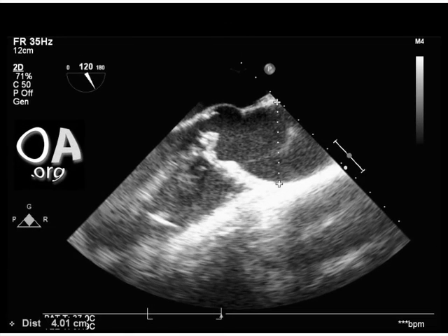This still image is a mid-esophageal aortic valve long axis view, found at a multiplane angle of 120 degrees. It is most useful for evaluating the aortic valve as well as the ascending aorta. Here you can appreciate the aneurysmal nature of the patient's ascending aorta, measured with the calipers to be just over 4 centimeters. A normal ascending aortic diameter is 2.2 to 4 centimeters depending on the body surface area of the patient.